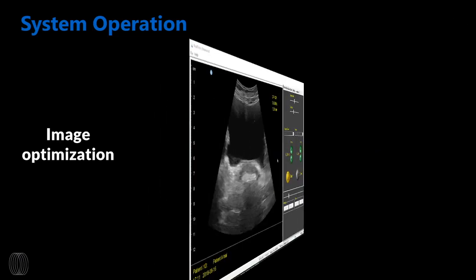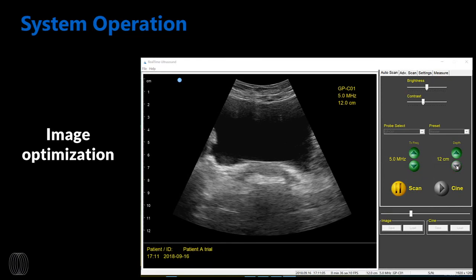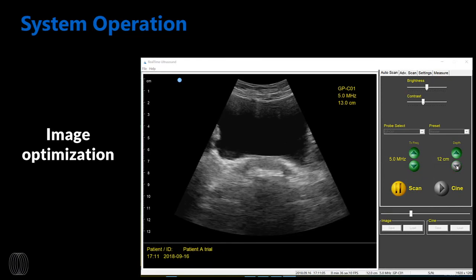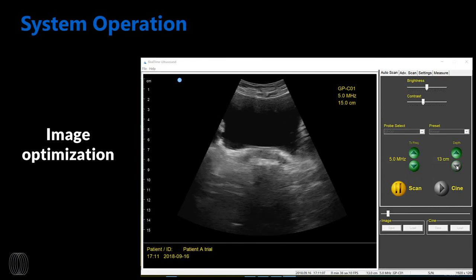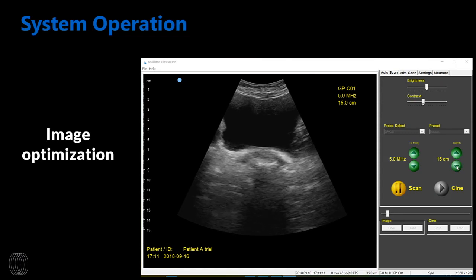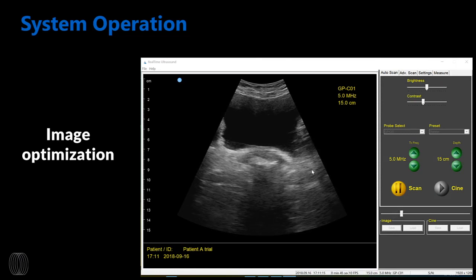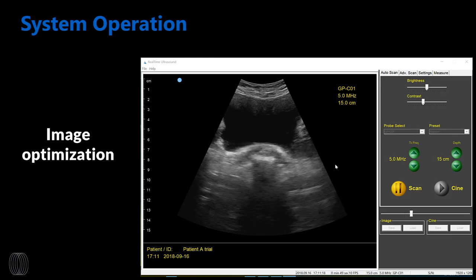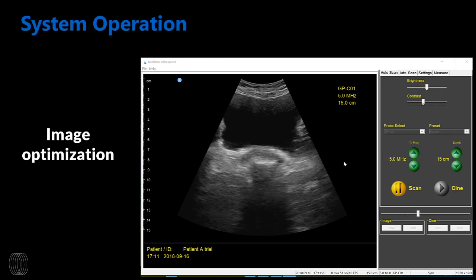In a different patient, using the same preset, the bladder is quite large. So an increase in depth proves helpful for obtaining correct positioning of the area of interest. The goal is to have the bladder in the upper third of the acoustic window and the pelvic contents in the center.